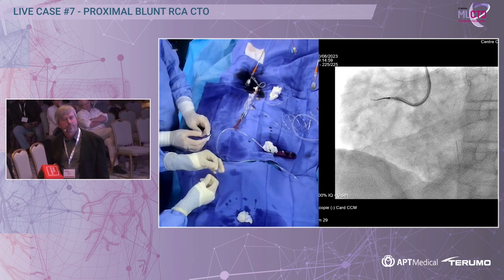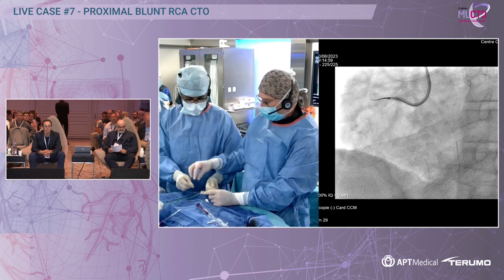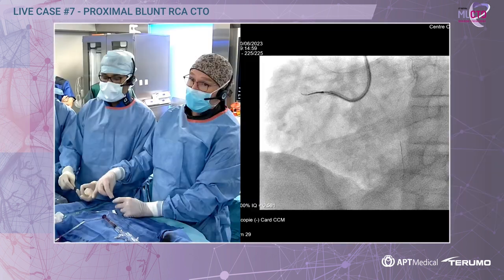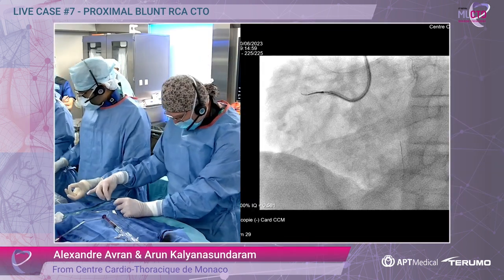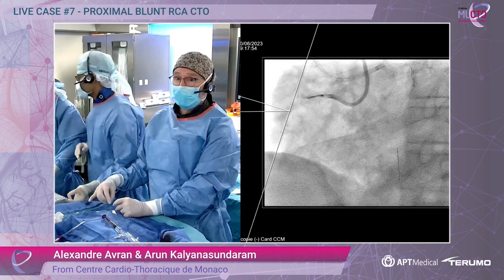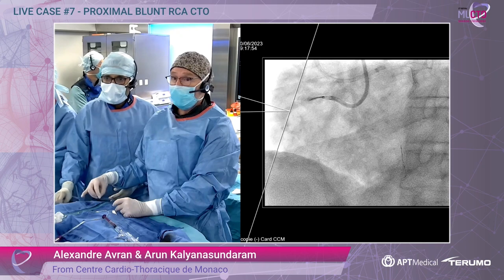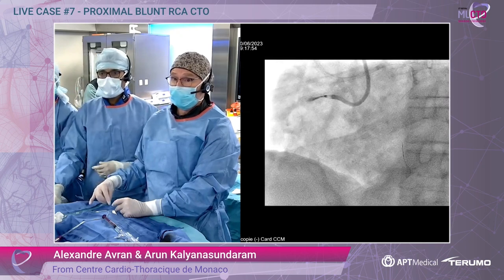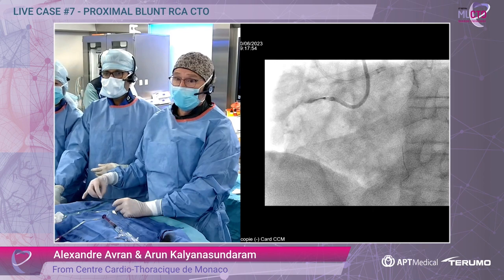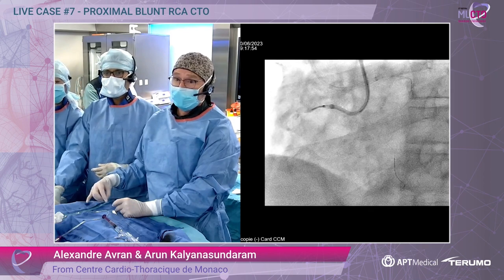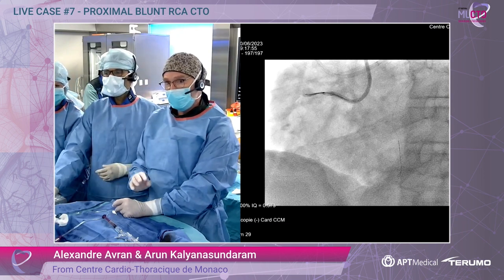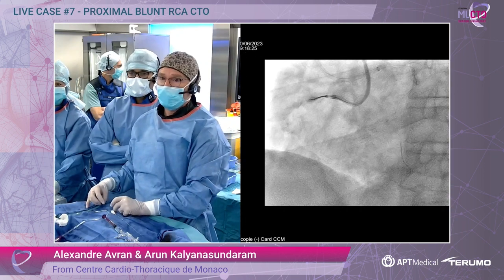First of all, I don't need 8 French here because I will not do an IVUS puncture. If I use IVUS, it will be after crossing. Seven French is enough. Also, there was an issue with the puncture point — there is stenosis on the femoral inside the stent — so that's why we try to stay a little smaller than 8 French. So this is the Gladius MG. I'm just tracking the architecture of the vessel.